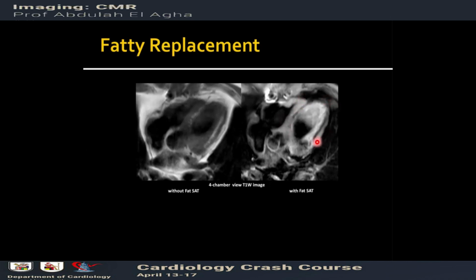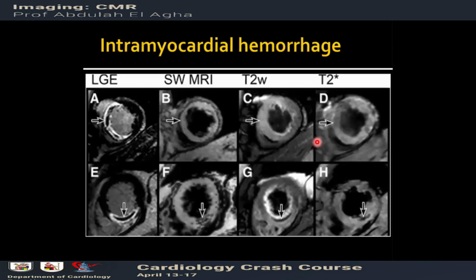Also in viability, I can look at the fatty replacement. Also, some patients have a complication called intramyocardial hemorrhage post-MI. This is one of the complications, like the mechanical complications, a serious complication that happens in the heart. This will worsen the prognosis. This patient has intramyocardial hemorrhage.